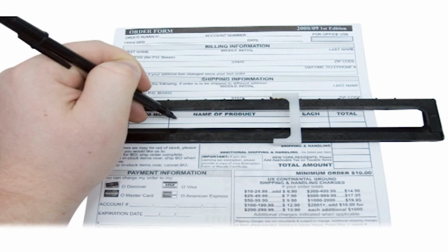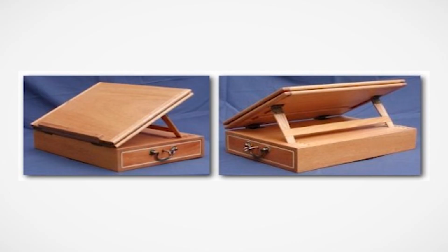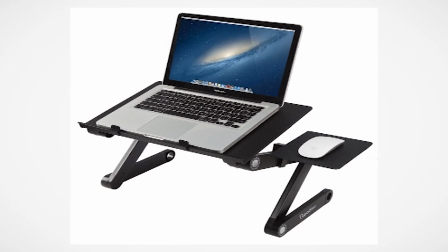Writing guide. Most writing guides use plain paper and a space within the guide frame that provides tactual boundaries for the writing line. Raised top desk. Some students prefer a sloping surface for reading and writing. Raised top desks are available, or portable reading stands can be placed on a flat surface. Students working on computers or typewriters use a variety of commercially available typing stands which position material within a comfortable working distance. It is used to avoid back strain or facilitate proper positioning of the reading surface.